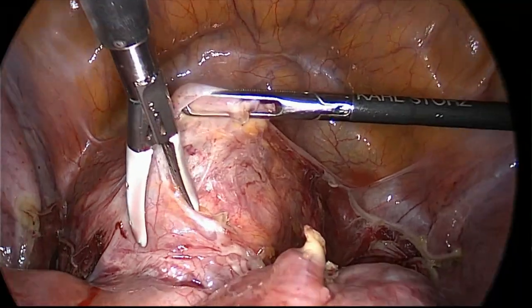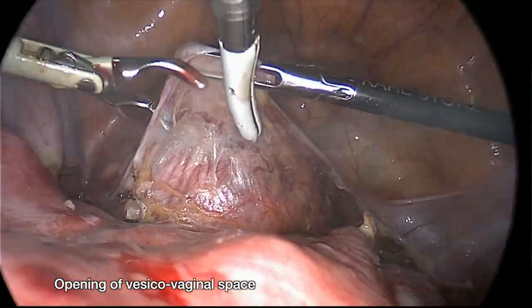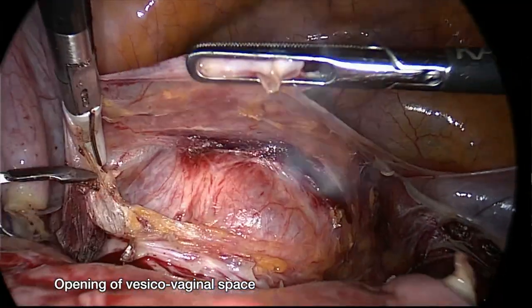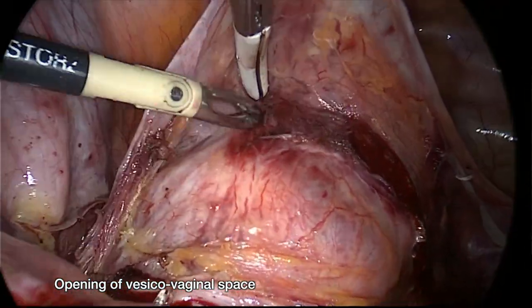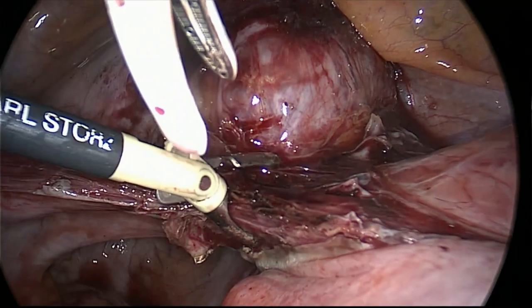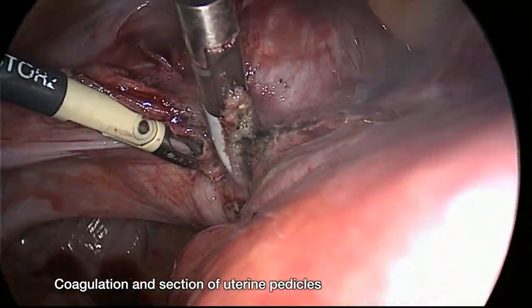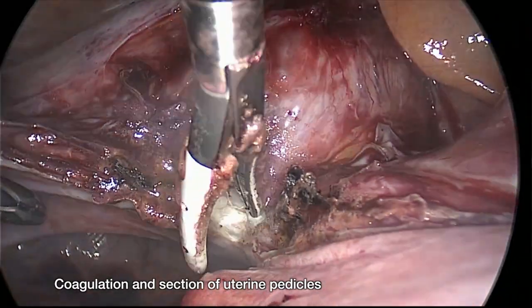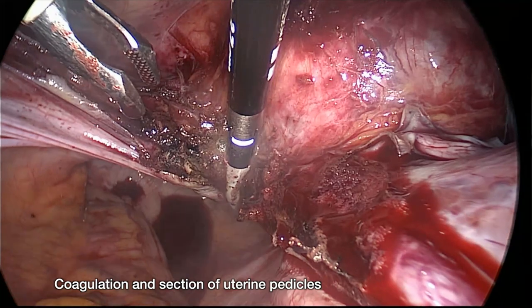Then we open the vesico-vaginal space, followed by coagulation and section of the uterine pedicles. As you can see very clearly, we coagulate and cut the uterine artery.